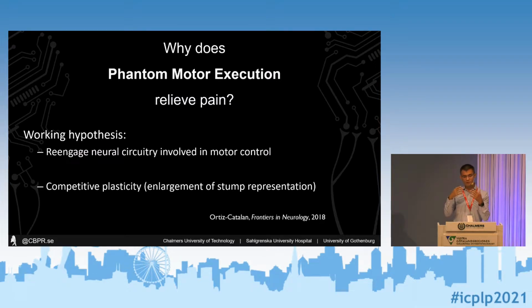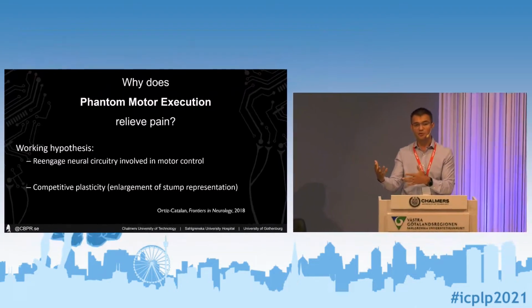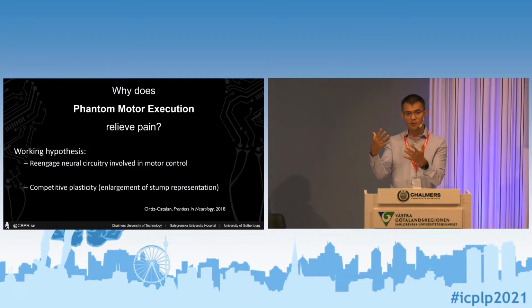And when you have conscientious or mindful execution of movement, that is when plasticity takes place, right? Mindless repetition of movements doesn't cause any change. Because myoelectric pattern recognition is not a perfect technology that just picks it up as soon as you do it, you have to concentrate when you're trying to do the movements, to learn how to do them, potentially not even using the natural patterns.